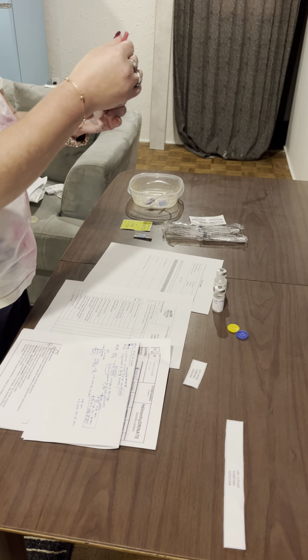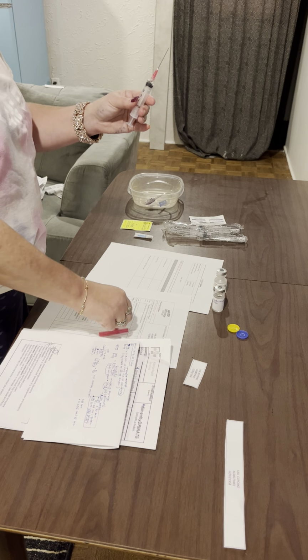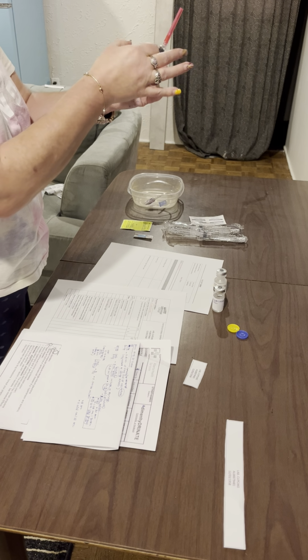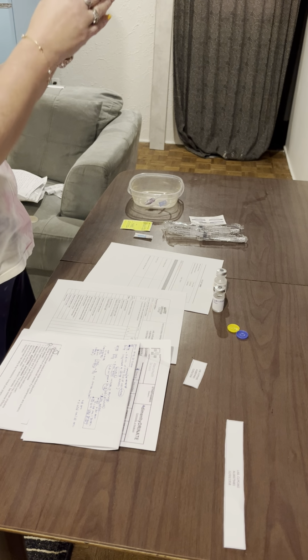Before we recap, we should also make sure that there are no bubbles in here. Recap and then do bubbles as well. If there are bubbles in here, it will ruin the concentration of the medication. So we'll just tap that. Tap to get all the bubbles out. Doesn't appear to be any air. Don't appear to be any bubbles.